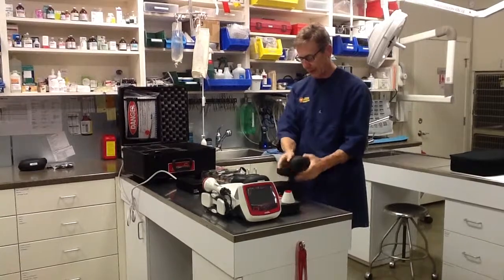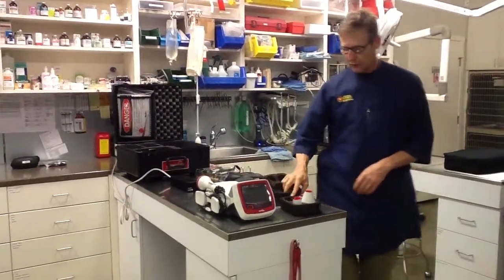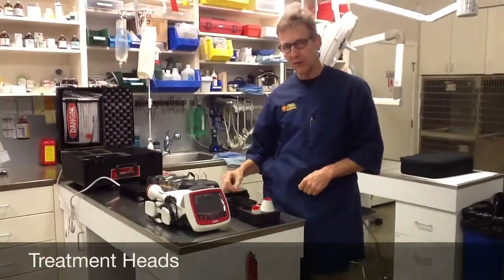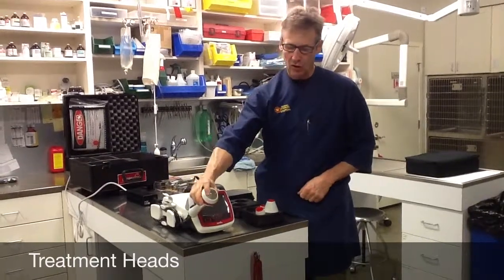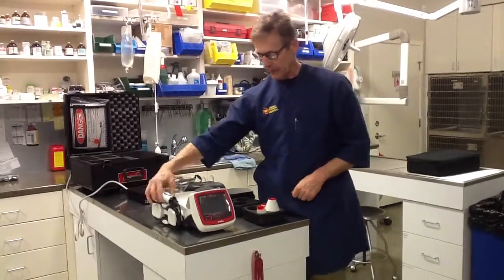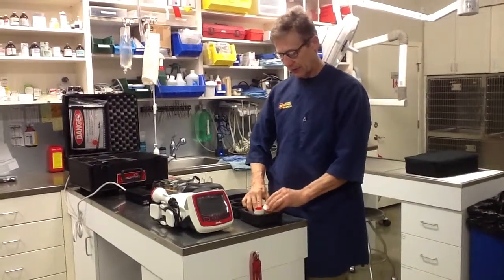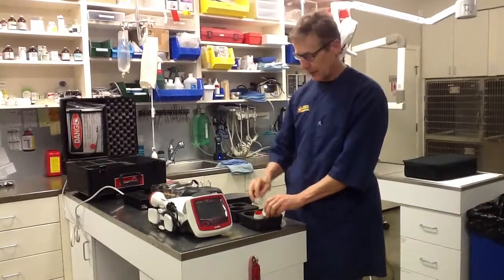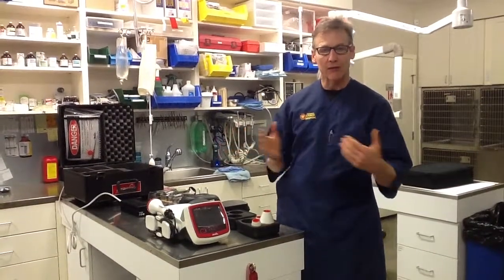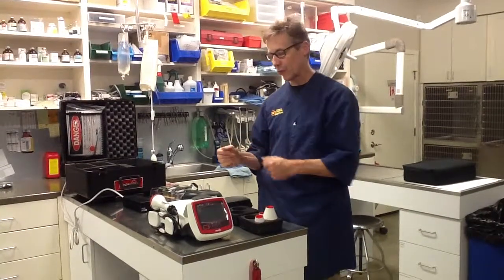The other components you're going to find are the treatment heads. You have two sets of four — I put one set back in the soft case. We have the large contact head, the small contact head, the large non-contact head, and the small non-contact head. Just so you know, the small heads are for 5.9 watts or less, and the large heads are for 6.0 watts or greater.